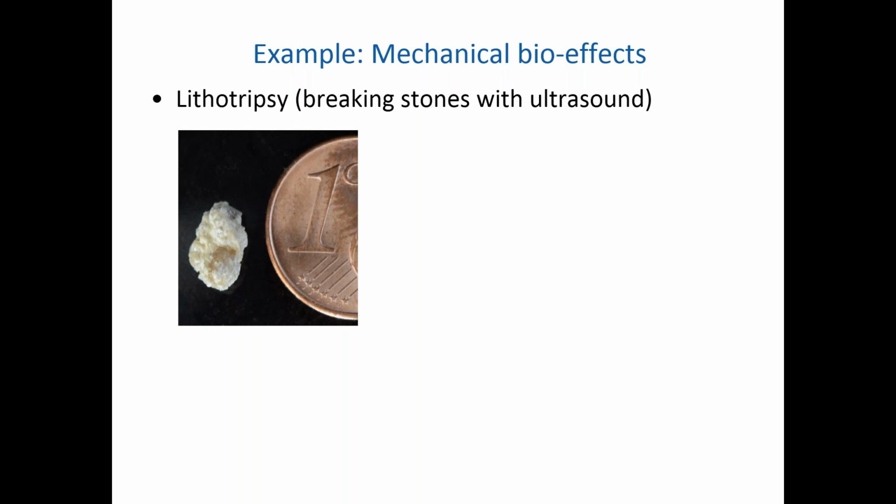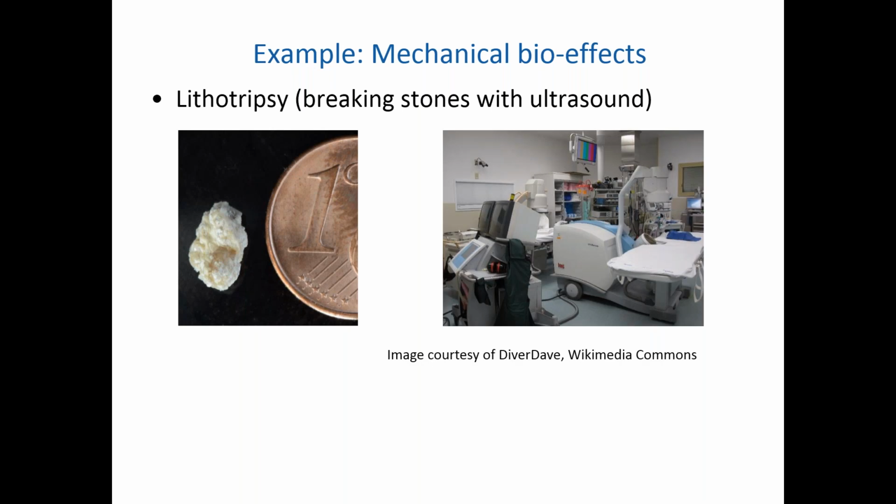In this case, it's a rather rough structure, but there are all sorts of variations one can find in stone morphology. And the lithotripsy itself is likely to be the sort of thing that we would see on the image on the right-hand side, where we've got the shock head down here next to the bench on which we're likely to find the patient lying.